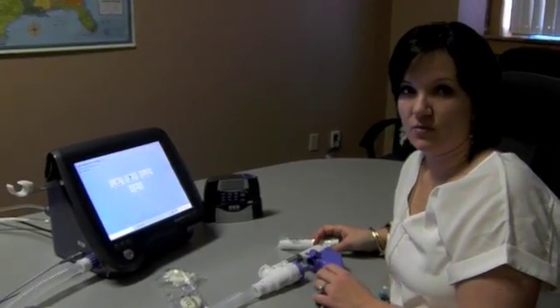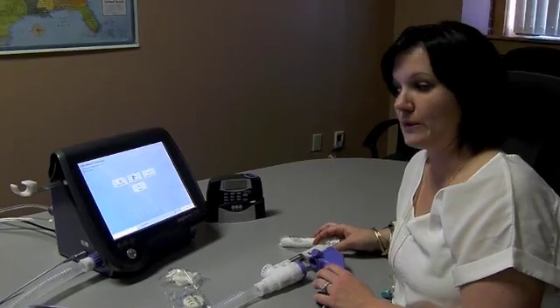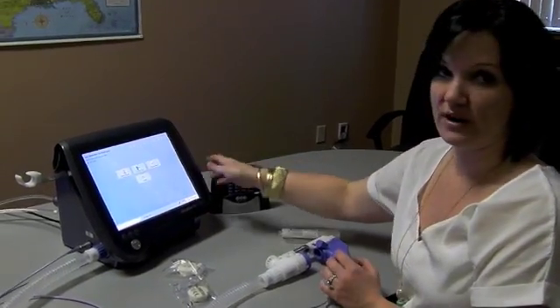Today we're going to be performing a nitrogen washout test on the EZ-1 Pro Lab. We're going to demonstrate how that's done.